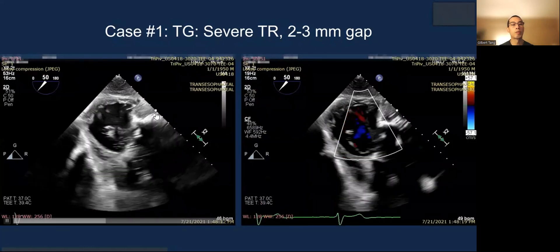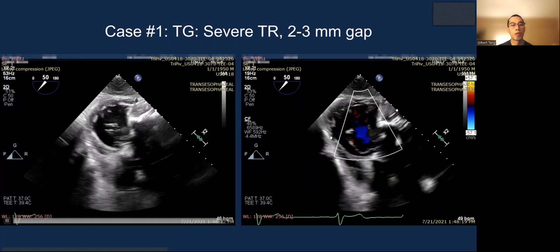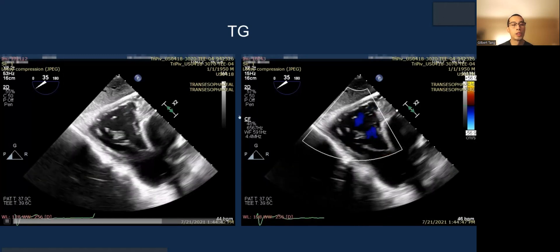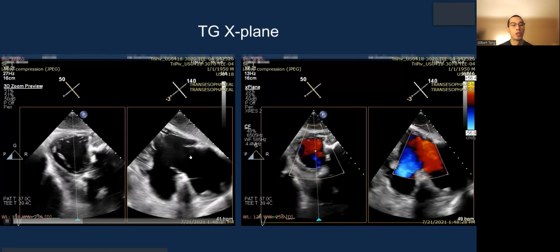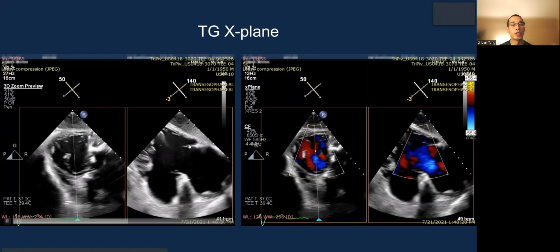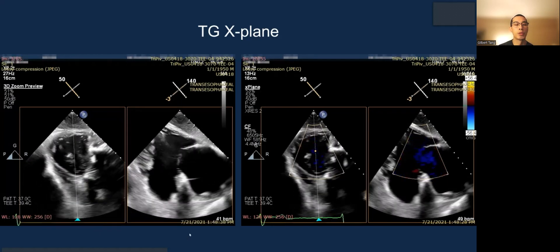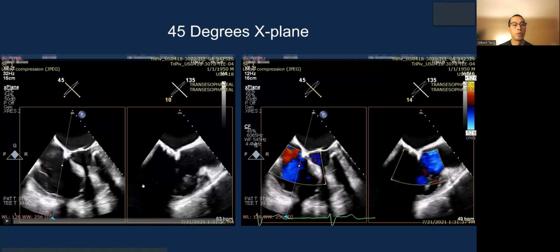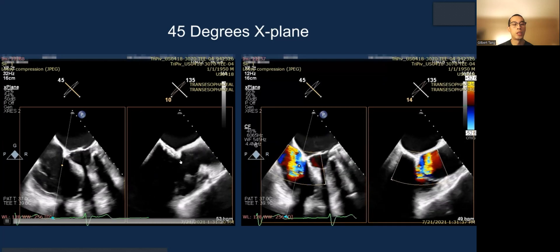Case 1: a patient with severe TR and a 2-to-3 millimeter gap. This is a nice transgastric view showing the anatomy and orientation without and with color. This is another view showing that, and this is a transgastric X-plane — you don't necessarily grasp on this plane, but it is very helpful and was previously one of the key grasping views before 3D MPR became widely available. You also have the standard four-chamber view to see the leaflets, and the 45-degree X-plane to show RV inflow.